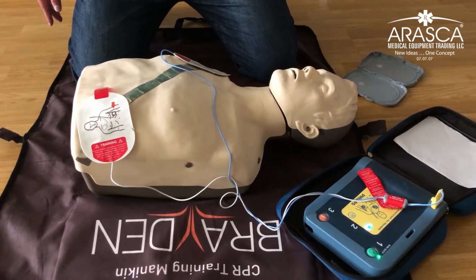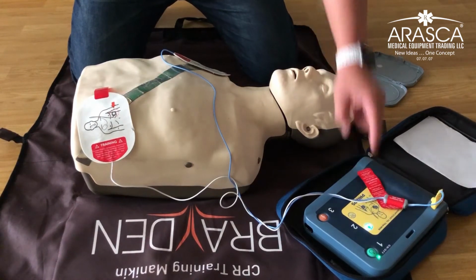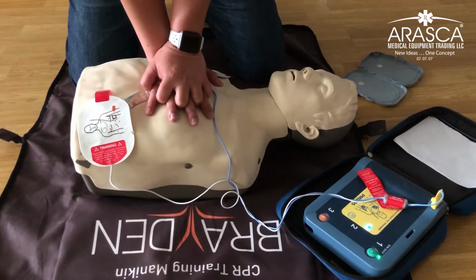Start CPR. For help with CPR, press the flashing blue button. Place the heel of one hand in the center of the chest between the nipples. Place your other hand on top of the first.